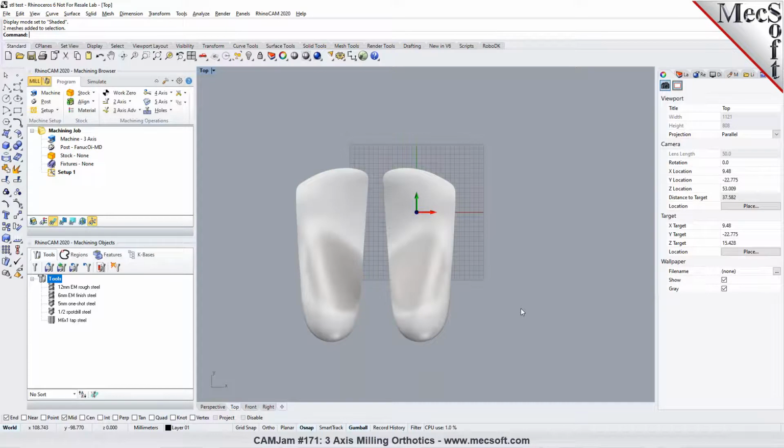Now, do you know what type of machine and controller you have? Well, it's a SmartShop. We bought it at Laguna. I think you guys do business with them. So it's a SmartShop M2. Okay. And is it a 4x8 or 4x4? What kind of travel do you have on the machine? It's a 4x8. Okay.